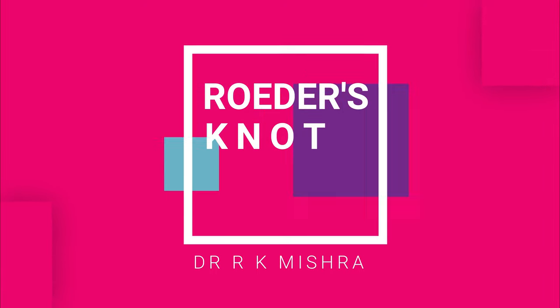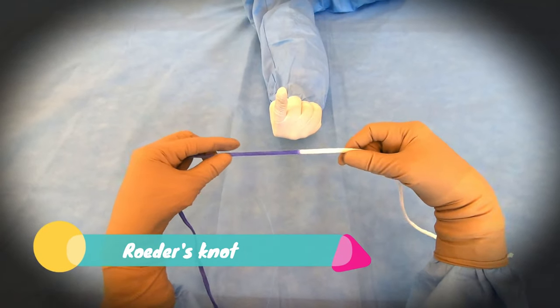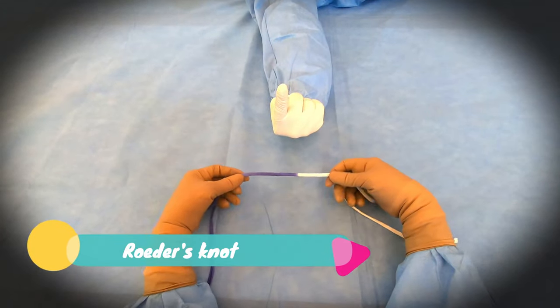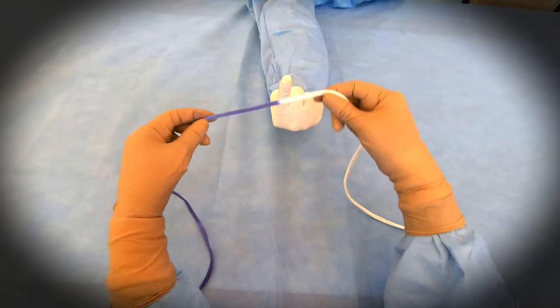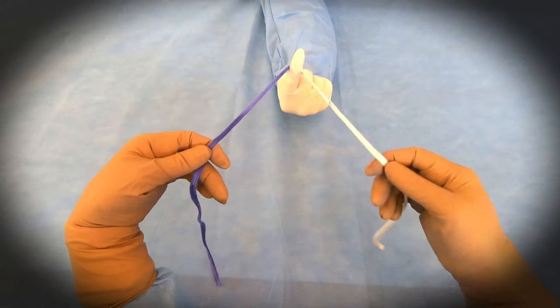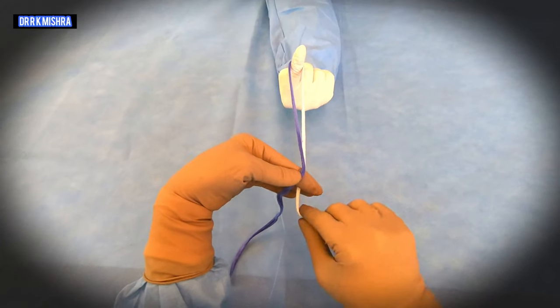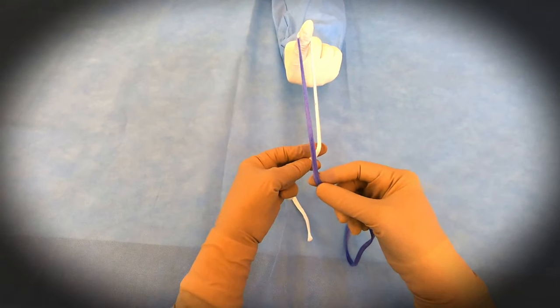Hello friends, today we will see how to tie Roeder's knot. You will ask the assistant for the finger. The shorter limb should be on the left side and the longer limb should be on the right side. After that, the shorter will be over the longer — this is how you put the shorter over the longer.